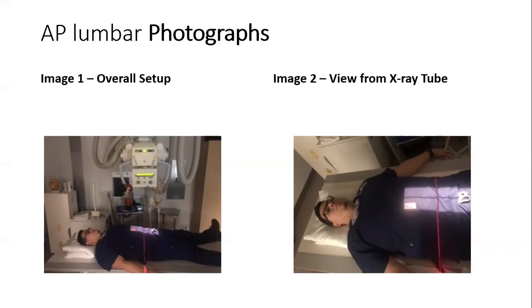I verified the image that the doctor requested was an AP lumbar via email. I visually confirmed that the SID was exactly 40 inches by the screen in the tube, as well as using the tape measure located on the tube.